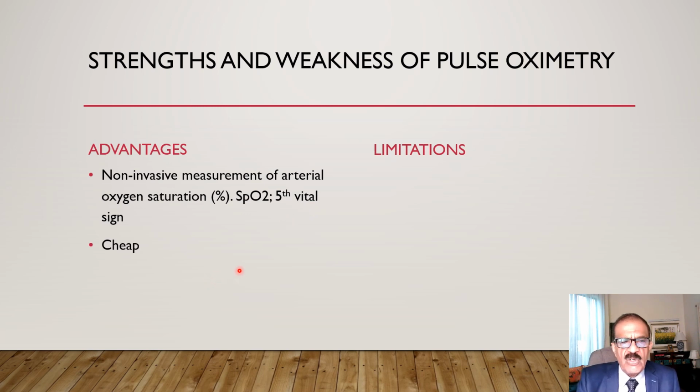It is incredibly cheap, the device is only a couple of bucks, and all it needs is just a battery, so it's very cheap, very affordable. And if you are interested in change over the baseline, for that it is quite efficient.